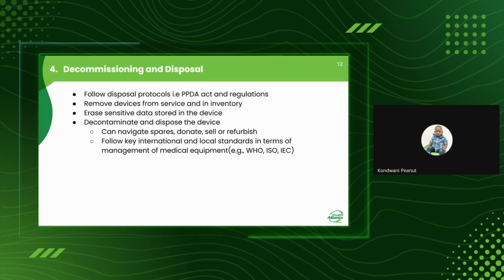And during all these processes, you need to follow all the standards, both international and local, in terms of management of medical equipment. So WHO has a series of standards that it has developed under medical equipment devices.